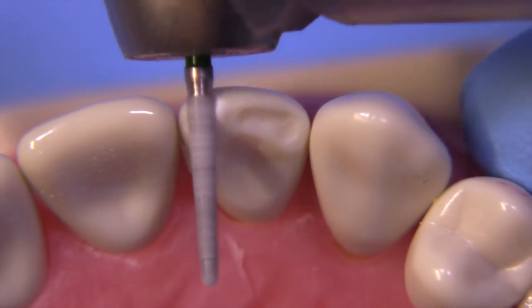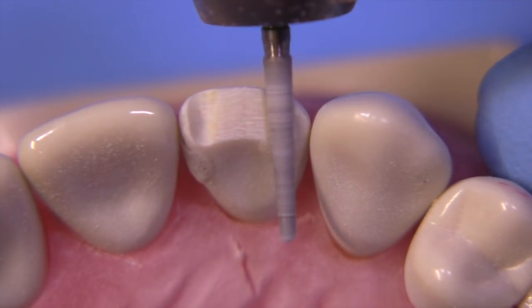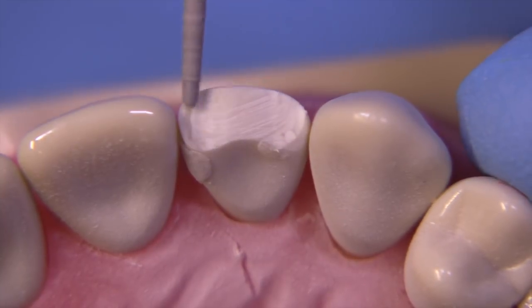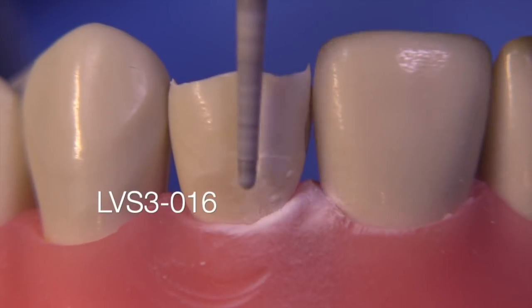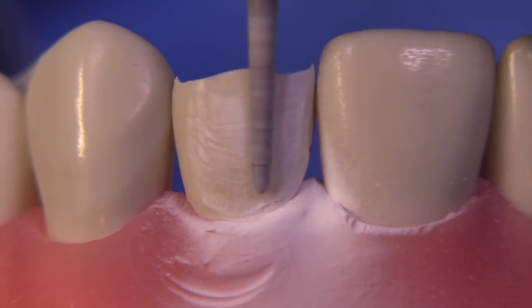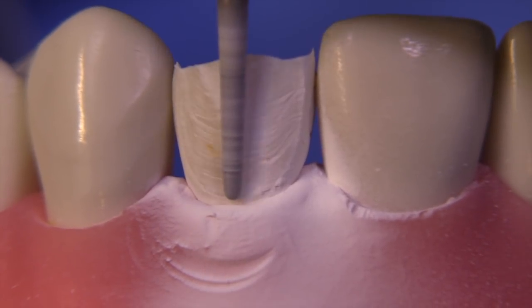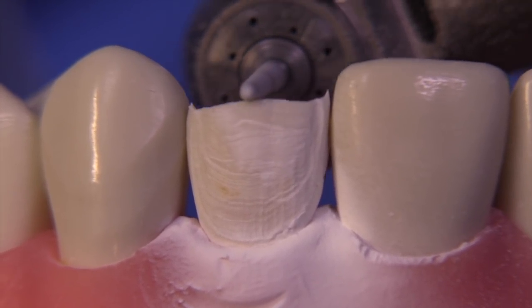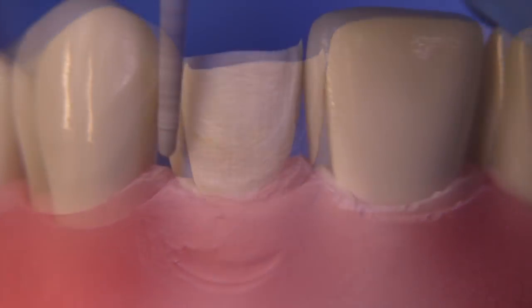We're going to work on this lateral incisor, which I've made a few defects on. I have a wear facet on the incisal that's exposing dentin, an existing very poorly done class 3 composite on the mesial, and a class 5 restoration on the facial. We're going to prepare this for the super veneer, starting with 1.5 to 2 millimeters of incisal reduction. In super veneers it may be more than 1.5 to 2 millimeters, and that's not a problem because the e.max can be cut back and layered to look beautiful. If e.max is three to four millimeters beyond the incisal edge, that's not a problem — it's made for that. We're going to focus on getting the tooth prepared nicely with adequate space for the e.max.